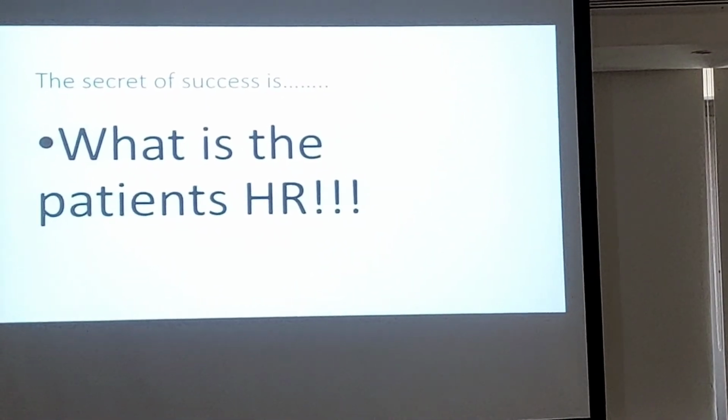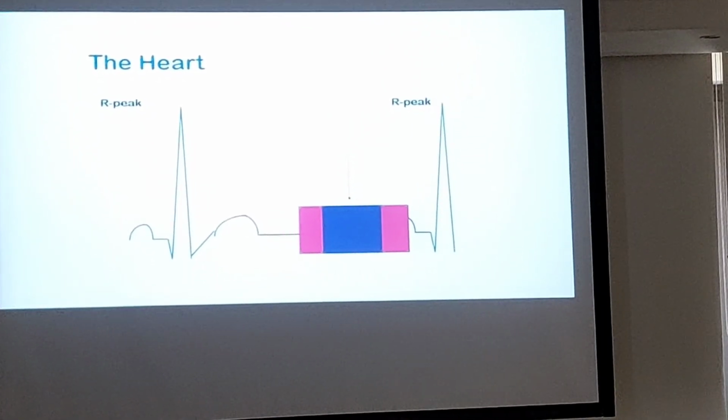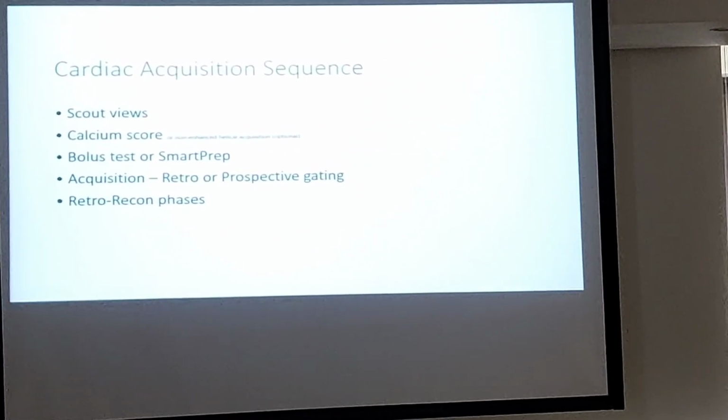The secret of the success is definitely the patient's heart rate, and these are the phases that we will need. Now we will be talking about the position itself.